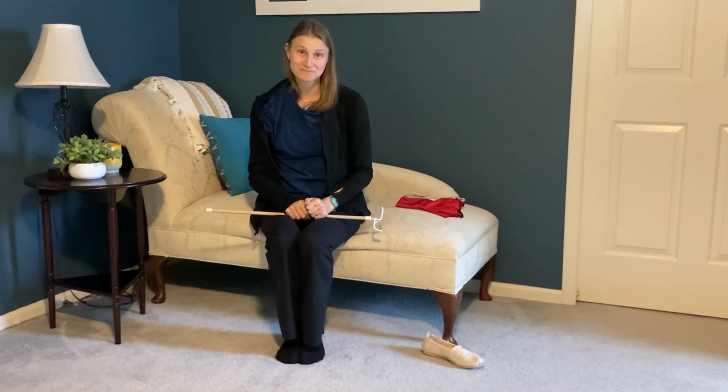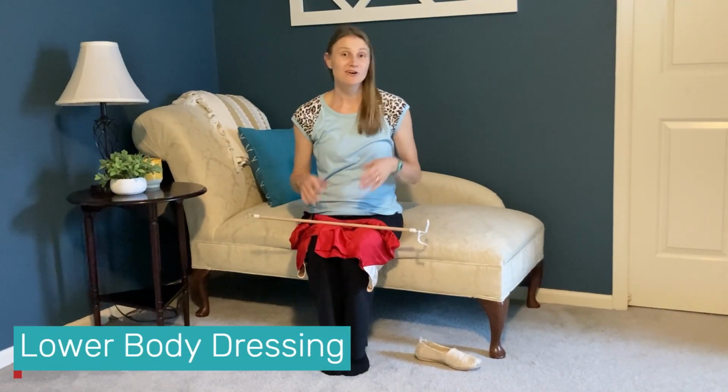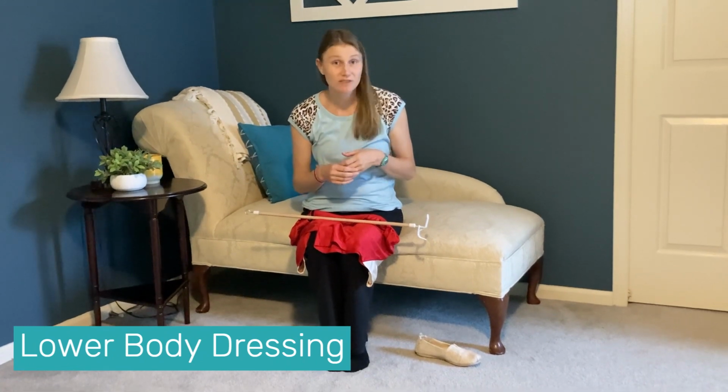Now we're going to shift to talk about how you can use the dressing stick to help you with your lower body. There are many devices that you can use to help with lower body dressing, your dressing stick being one of them. The dressing stick can be used to help with putting on your pants.